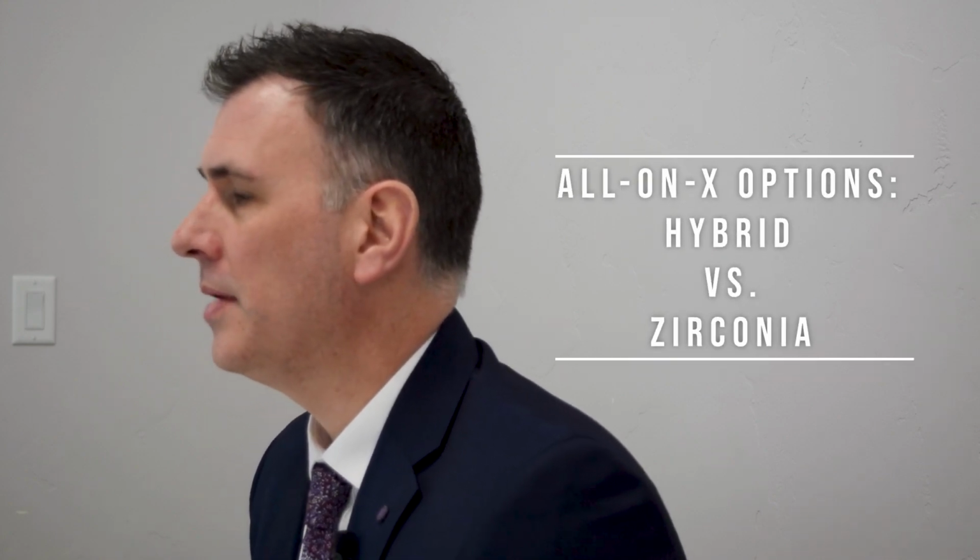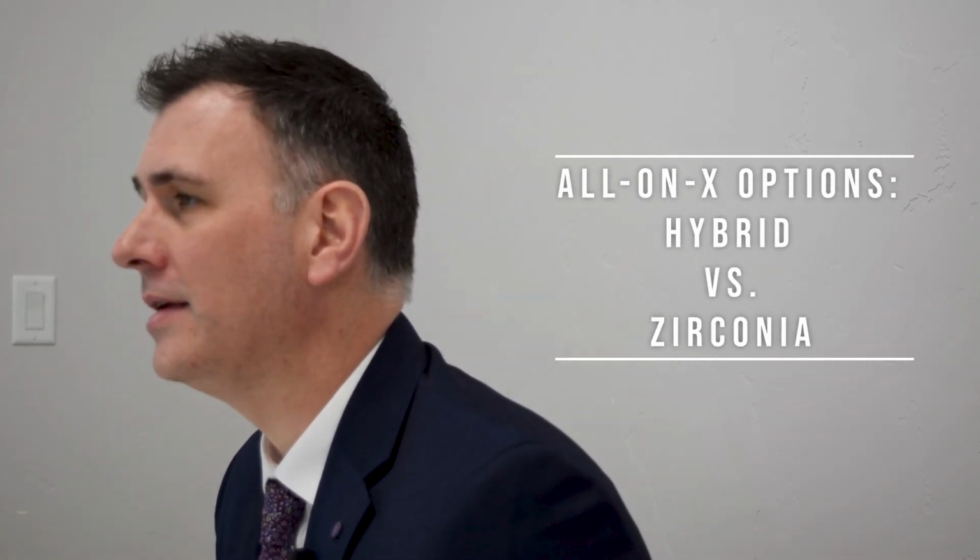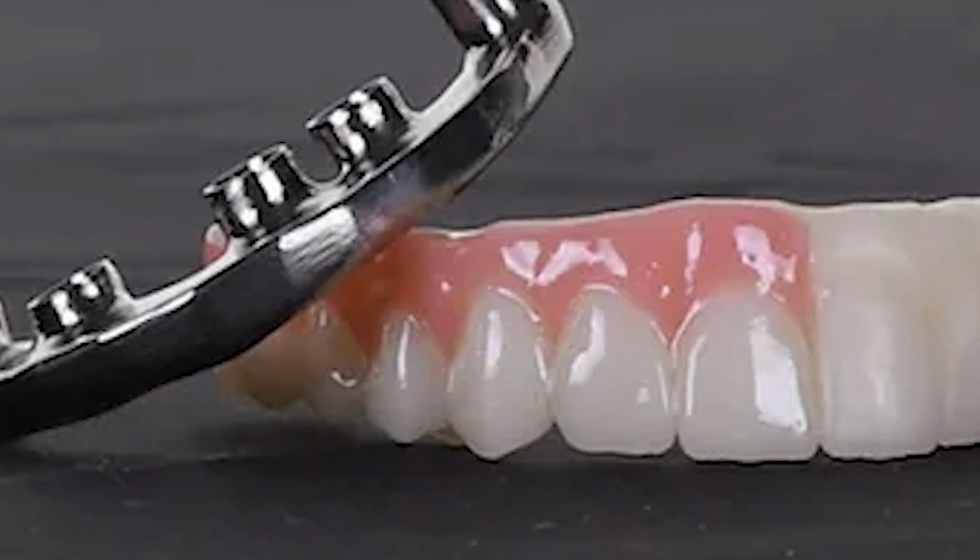Okay, so after the Snap-on, the next best option is the All-on-X, the permanent option, which is such a tremendous option. But even in those materials, there's different options. So it can be permanent, but the teeth that you're biting down on can be made out of different things. The first one we're going to talk about is the hybrid option. Hybrid means that it's a lot of different parts kind of coming together to function.